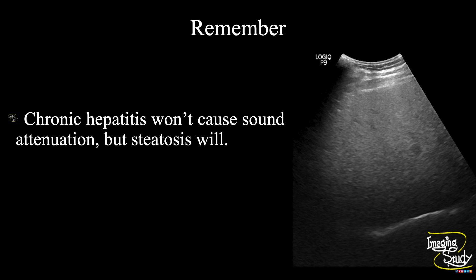In chronic hepatitis you won't see any sound attenuation — the distal and proximal parts from the transducer surface will show the same echogenicity. But in steatosis, due to fatty content, you will see distal darkness.